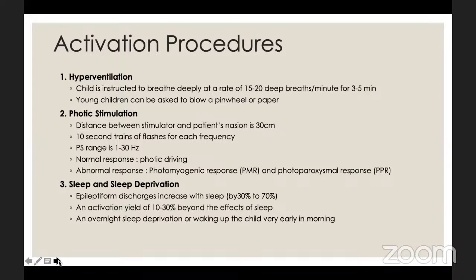In hyperventilation, the child is instructed to breathe deeply at a rate of 15 to 20 deep breaths per minute for 3 to 5 minutes. With children, it is sometimes very difficult to make them cooperate. So you can bring a pinwheel or colorful paper and ask them to blow at the pinwheel. For photic stimulation, the distance between the stimulator and the patient's nasion should be approximately 30 centimeters.